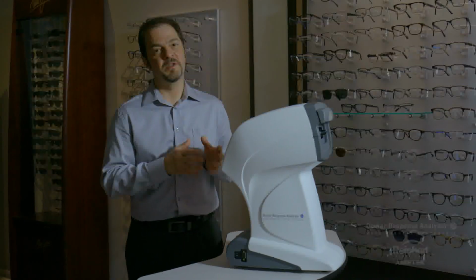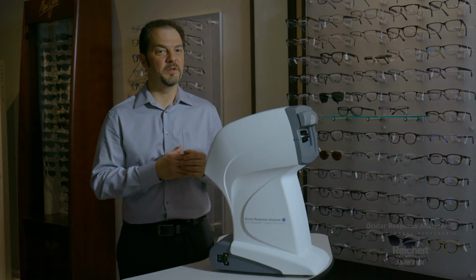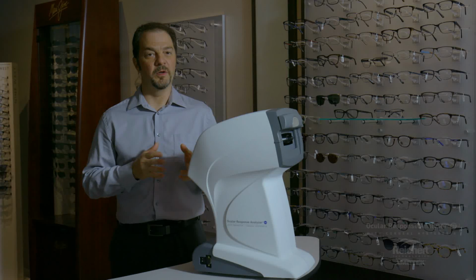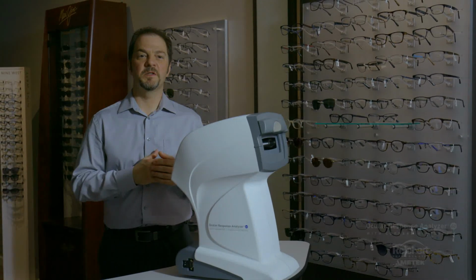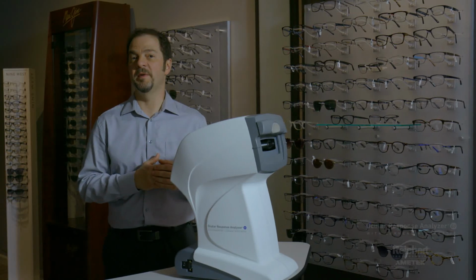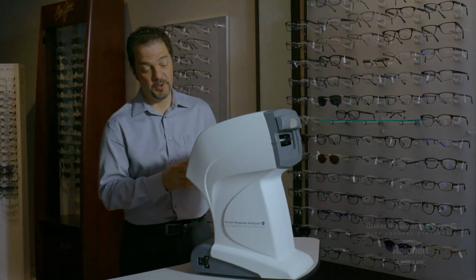If cleaning doesn't resolve the low waveform score condition and you're positive that you've cleaned the surfaces properly, then maybe it's time to call Reichert. You can look up the contact for technical support on our website and discuss this with the technical support representative at Reichert to see if the machine may be in need of some service. When you think it's time to clean the instrument, I'm going to show you how to do that.